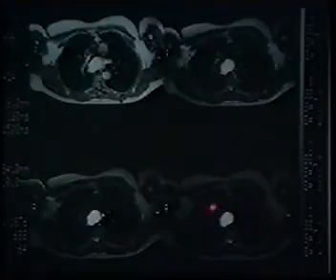And then at the point of interest, or at the section of interest, what we perform are single-level multi-echo sequences. And so this represents a 30, 60, 90, 120 millisecond echo. And in fact, we typically take it out much further than that, into the 200 range. And by doing that, giving us a very heavily T2-weighted sequence, you can see that this mass that is subcarinal clearly is fluid-containing and is typical of a bronchogenic cyst.